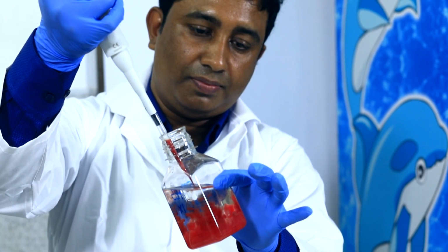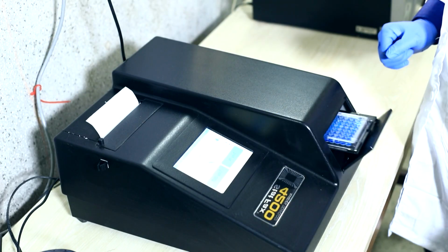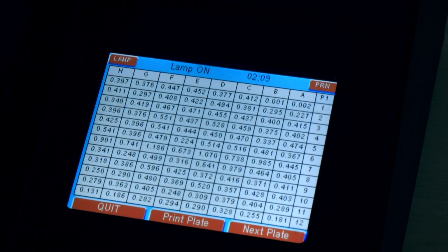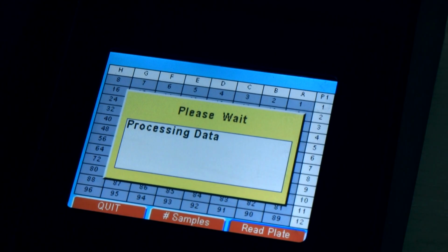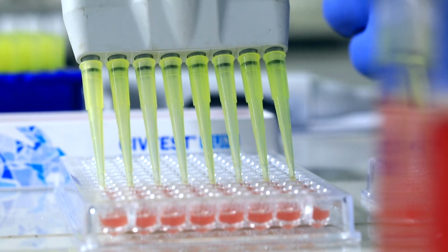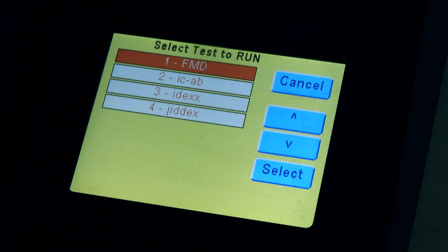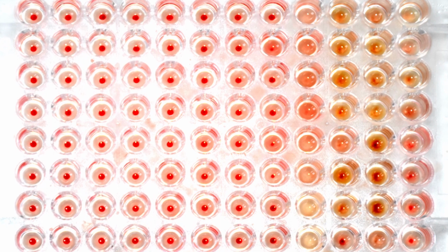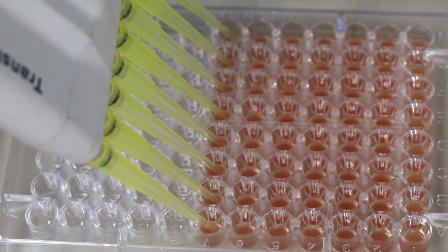A series of serological tests have been practicing in this lab to find antigen antibody level for pathogen in livestock species. Major tests are done to analyze vaccine-induced antibody titer. Serological tests are done on potential diseases of poultry. Serological tests are also done for FMD and PPR. Common tests include hemagglutination, hemagglutination inhibition, and different types of ELISA.